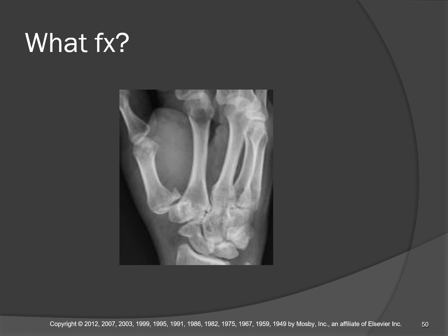So it's a good radiograph. It actually provides nice isolation of the first metacarpal. The first metacarpal is nicely separated from the rest of the anatomy, no superimposition, and you can clearly see that there's a little piece that is chipped off of the base of the first metacarpal bone.